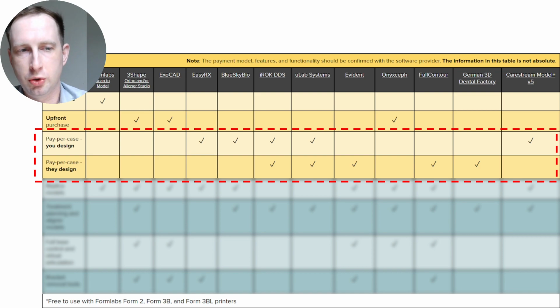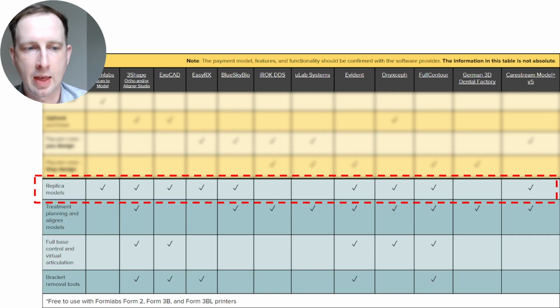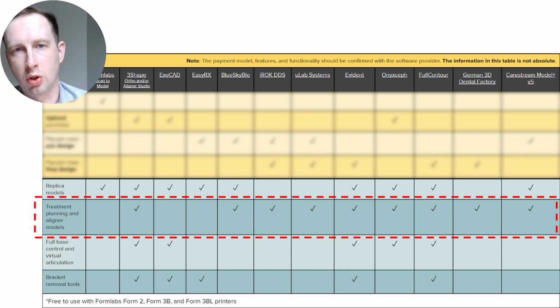So those are the business models we're looking at with all these software, and then functionality of these software. And so replica models, right? Many of these will do replica models, and a lot of these software will have more functionality like hollow models and engraving and other things. I think a good one to point to is EasyRx. It is a pretty easy, pretty powerful software that I would definitely check out. And then treatment planning or aligner models. So this is, again, what I was mentioning earlier.